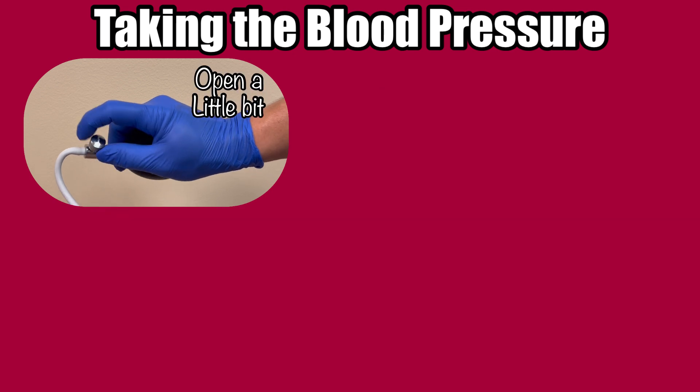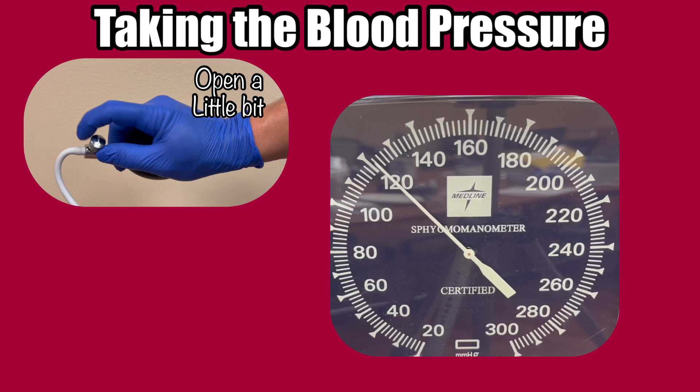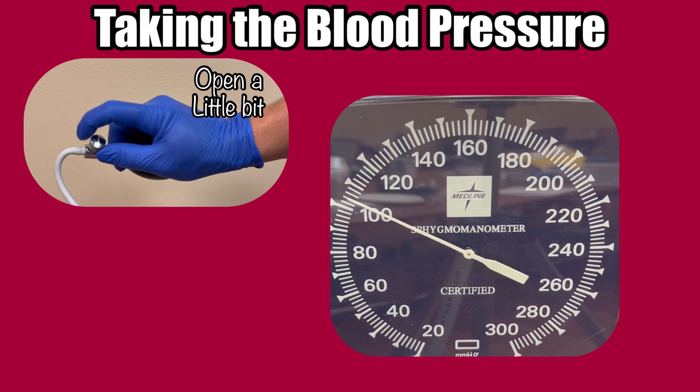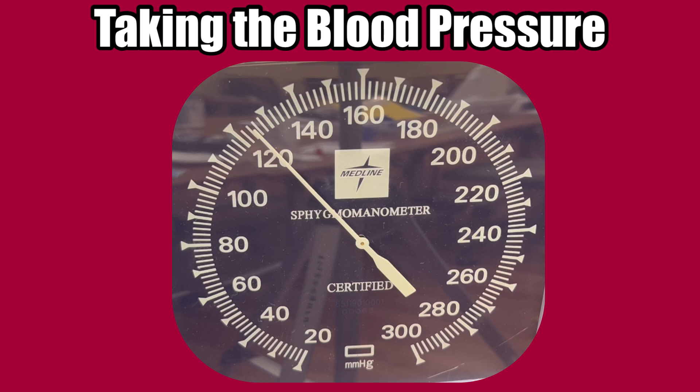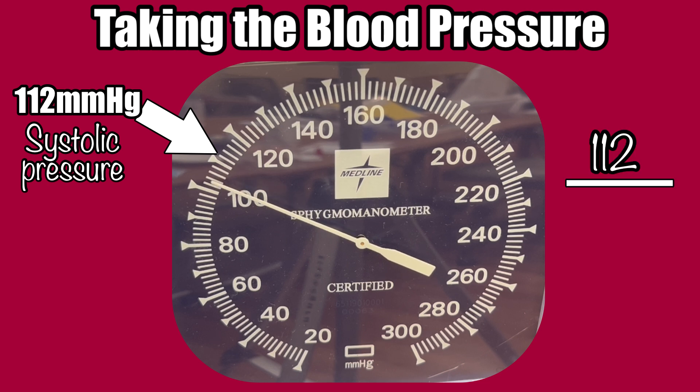Twist the knob very slowly counterclockwise. The needle will begin to lower as air is released from the cuff. The goal is to drop about 2 millimeters of mercury with each heartbeat, and that requires a very slow release of air. Watch the gauge as you listen through your stethoscope. You'll soon hear a whooshing and thumping sound. Take note of the number the needle points to the first time you hear that thumping — that number will be your systolic pressure, or the top number of your blood pressure.